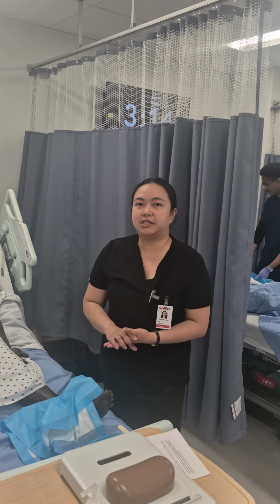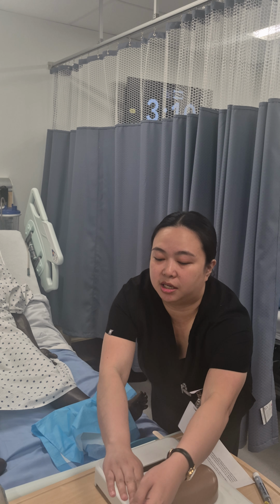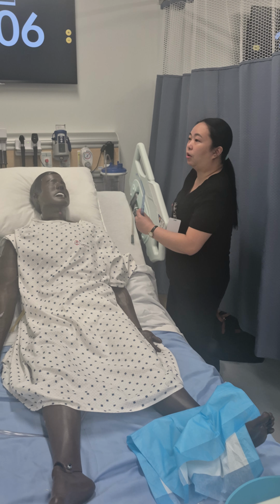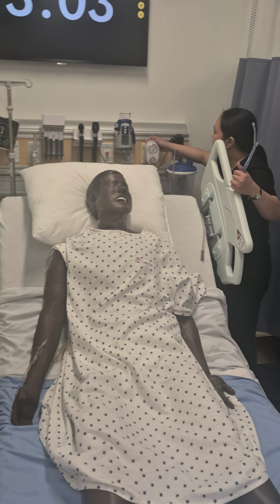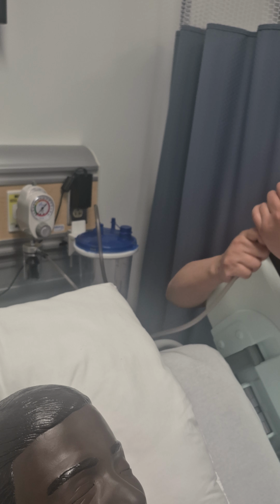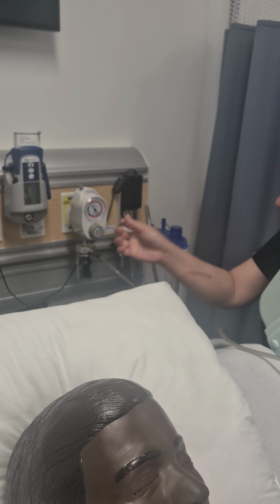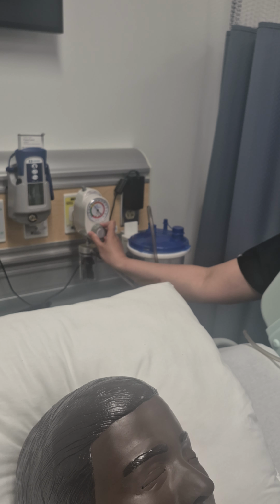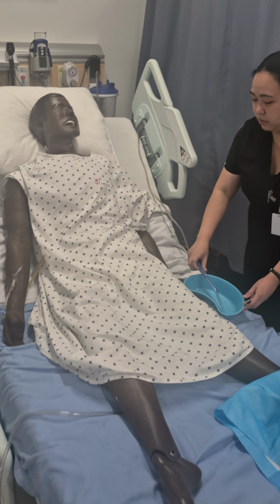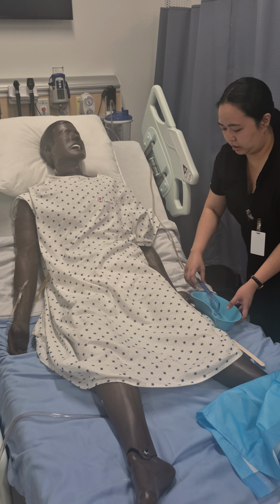Hi, my name is Laika. I'm going to do the oral suctioning for Mr. Smith who has pneumonia. So I'm going to do hand wash first. Then I'm going to set up a wall suction here. Before that, I have to connect the Yankauer just to make sure that I got the right pressure. So it's around 80 to 120. I'm just going to set it to 100. Then there's a solution in here. This one, and then clear.